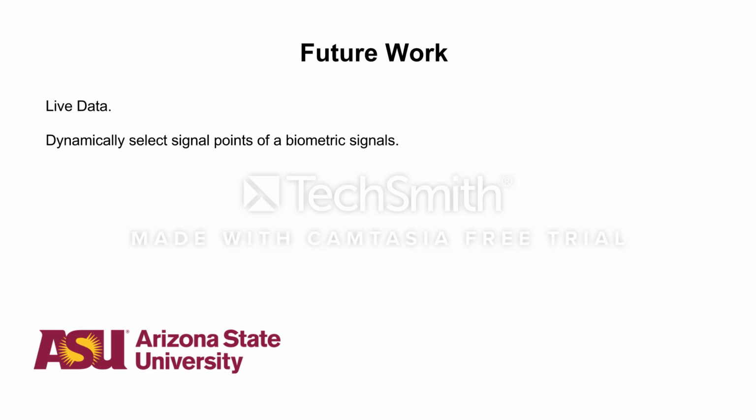So in this project, we've deployed, showing that we could read pre-recorded data and video, give them as input to the files, give them as input to the application. So the next future work would be reading them directly from sensors and camera. So that would be the future work, and also dynamically changing the signal points. Right now in the application, we cannot dynamically change the signal points of a particular biometric signal. So the future work would be doing it more dynamically.